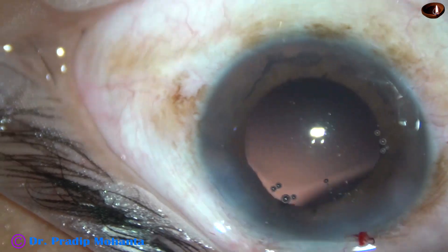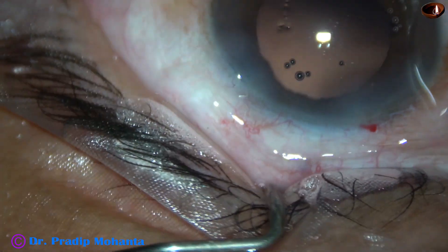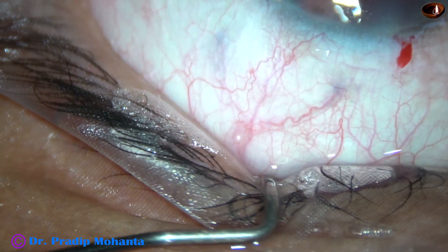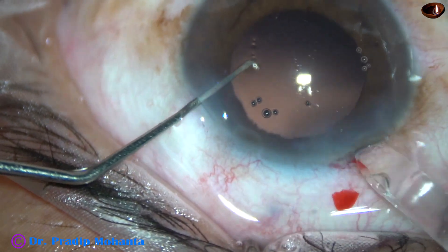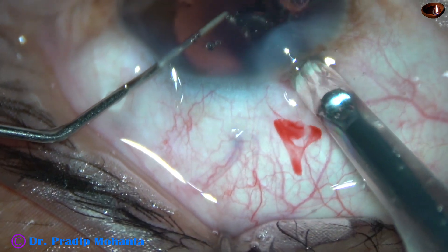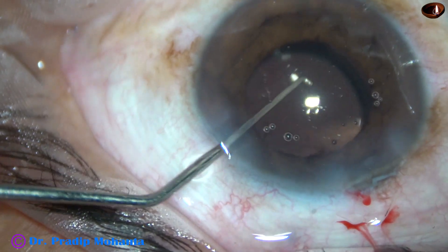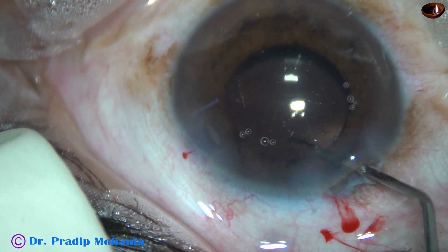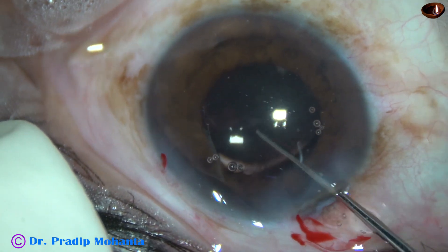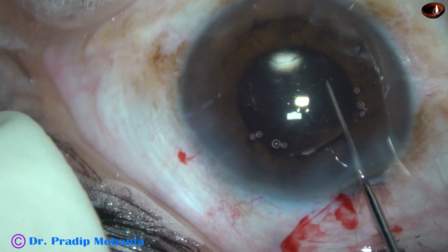I am going to use a B cartridge and enlarge the main wound a little bit, making the incision about 3 mm. Now implanting this intraocular lens from Johnson & Johnson — this is Sensar 1, a beautiful hydrophobic lens in which glistening doesn't occur. The lens is dialed and the haptics are in the equator of the capsular bag.